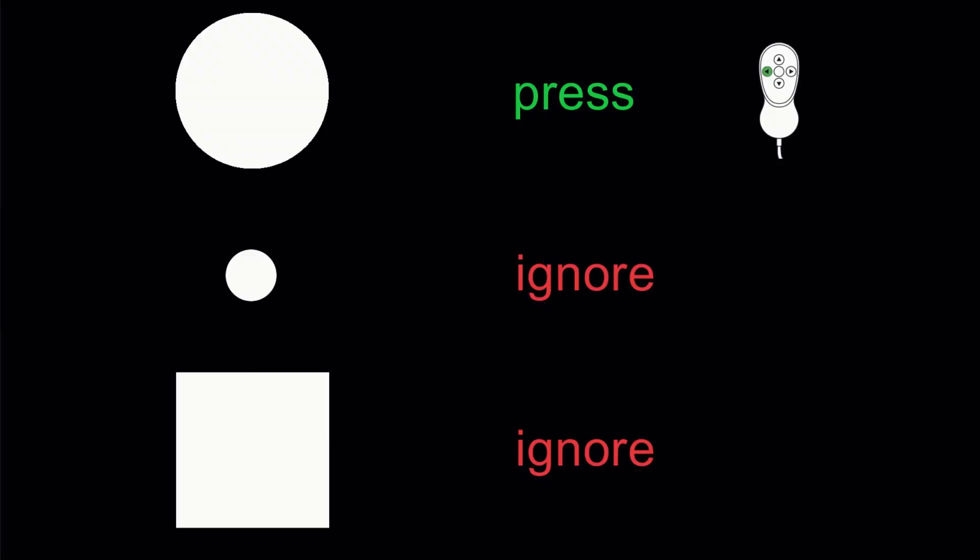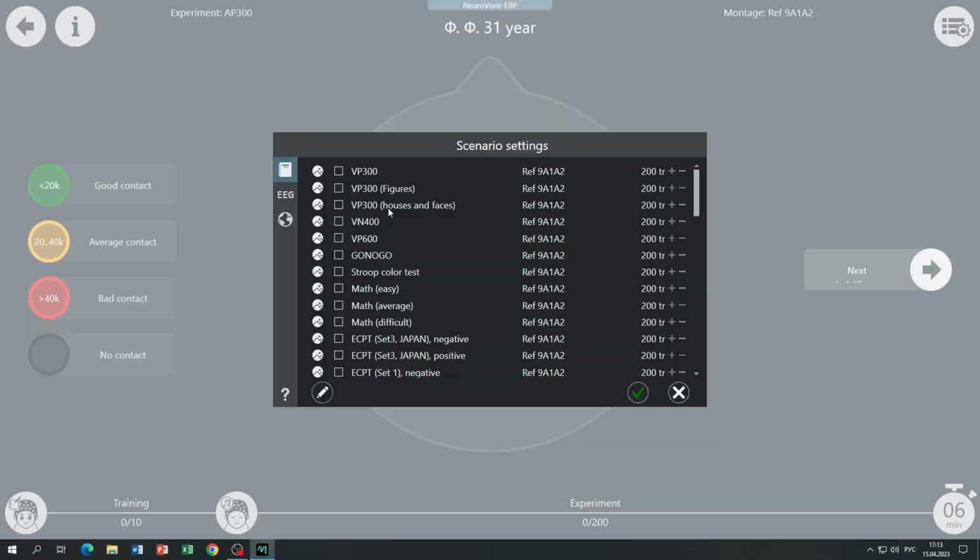or bottom of the screen. It can be images of buildings and people. It can be geometric shapes that use not only the standard and target stimuli, but also a distractor stimulus. These tests can be delivered in a simplified manner when the duration of the presented stimuli is increased. We will employ an auditory variant of the test today.